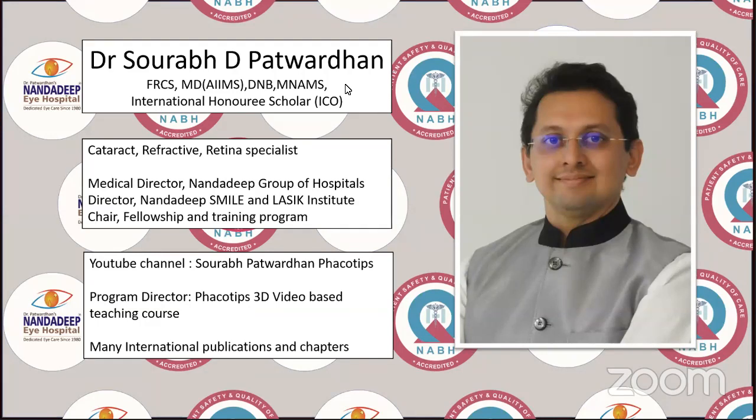And let's have a poll regarding the usual choice of OVD that you use as a stock OVD. Of course, in special circumstances, you may be using some other OVDs, but what is the commonly used OVD in almost 90-95% of your cases? I'll give you 5 more seconds to answer that. Okay, so most of the surgeons are using, as expected, 2% HPMC, and that's quite obvious because it is the least expensive one.